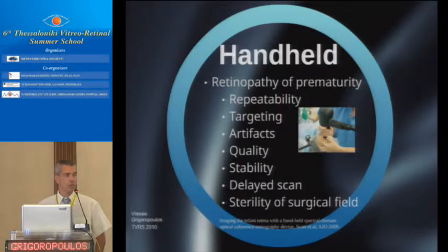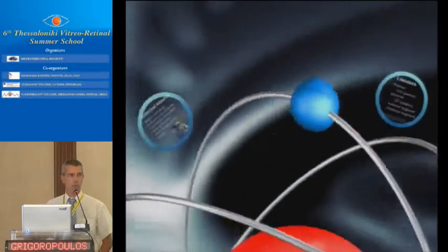And also you had to desterilize your surgical field. So you had your surgical field nicely done, and you had to desterilize and sterilize it again. So that would heavily disrupt your surgical flow. So really, that was out of the question.